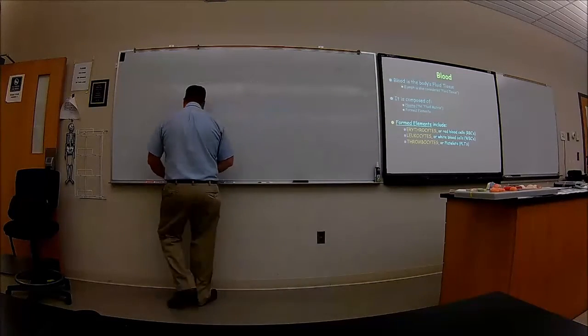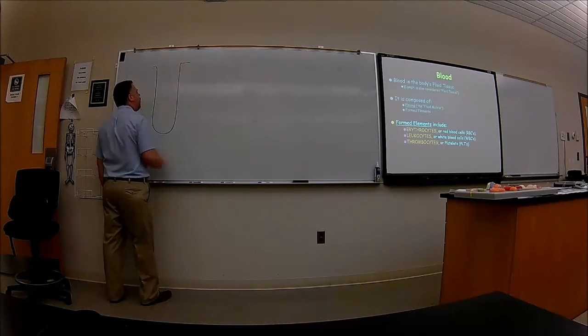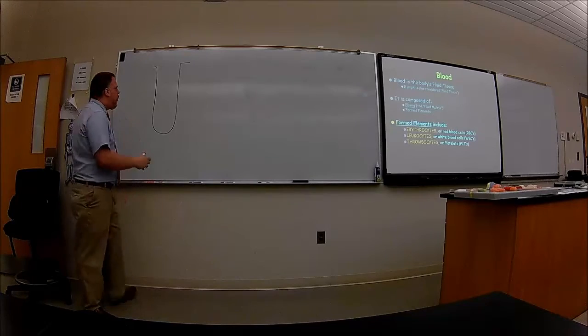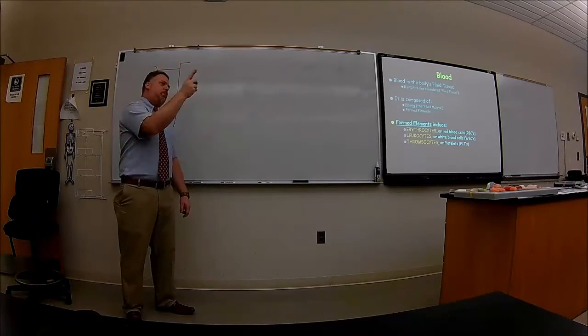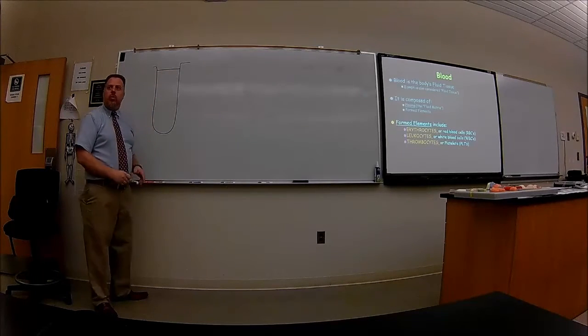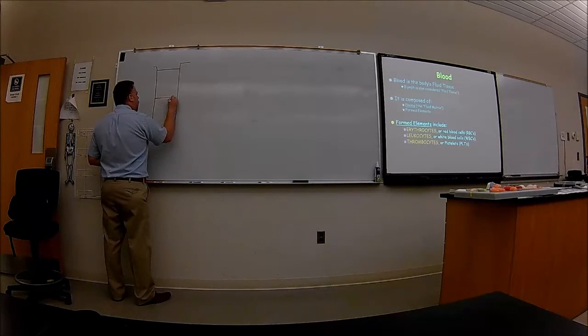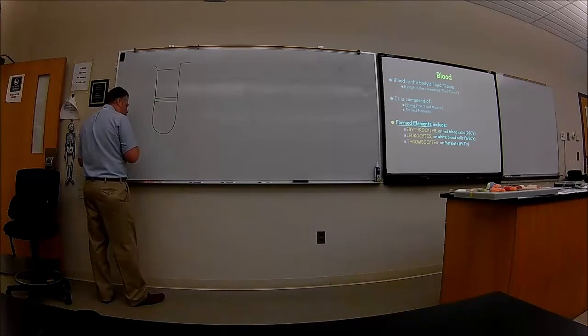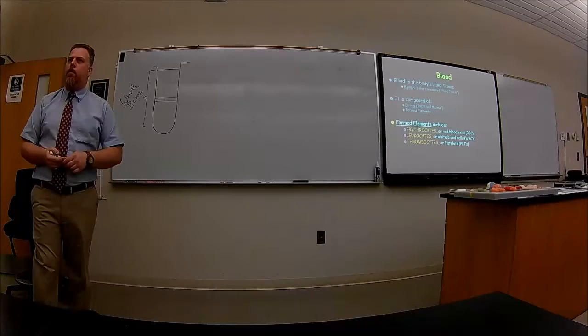So let me show you what's going on here. If we take a test tube, okay? We have some blood that comes out of you and we fill it up. Then we put this test tube into a centrifuge and spin it around for about 5 minutes or so. Then all the heavy stuff goes down to the bottom and all the light stuff goes to the top. Are you oriented there? Okay. When it does, you're going to have divisions. Now, all of this, when you look at the whole picture, is what we call whole blood. That's what you give: whole blood.